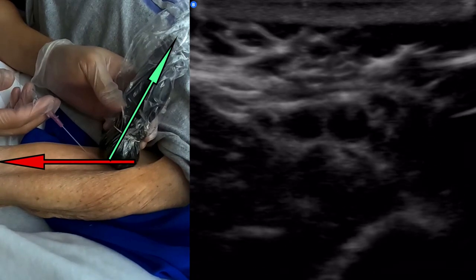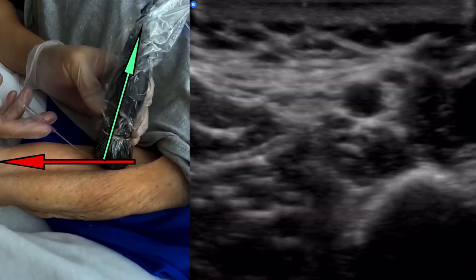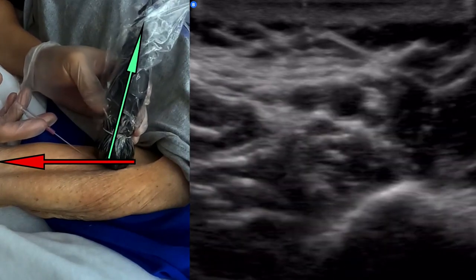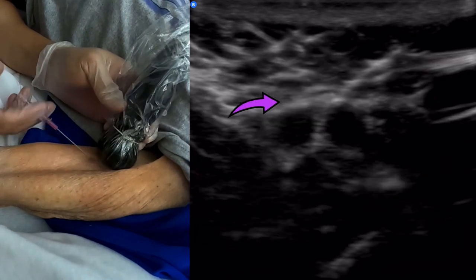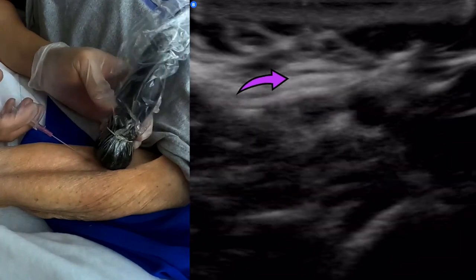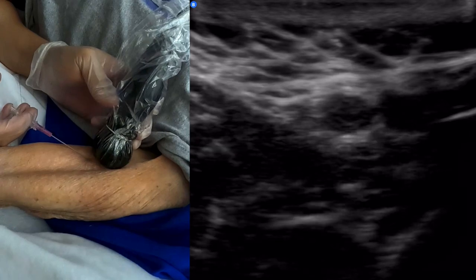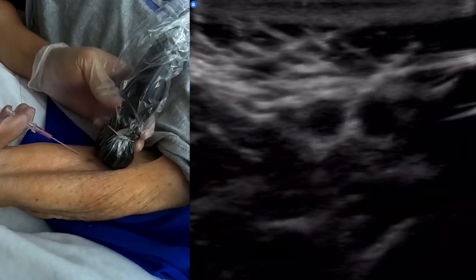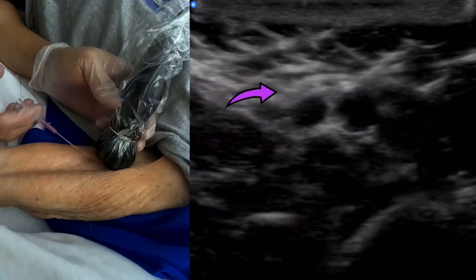There you go. Notice how I fanned. I can see the structures better this way, but I can see the needle tip better this way, all right? So you want to change the angle, rock the baby, and thank you for everybody who brought that up, rock the baby, okay? So change the angle of your probe to get a better image of where the needle is, right?